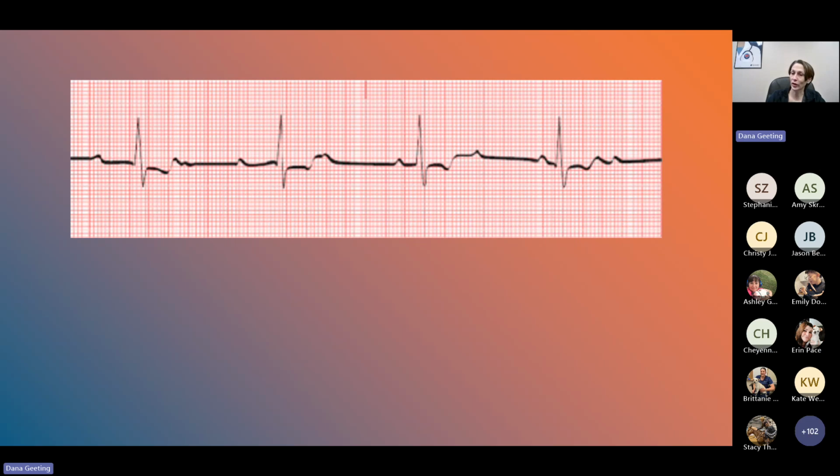First degree, again, very hard to tell. First degree are very hard to tell just looking at them on your heart monitors. A lot of times you would have to print out a monitor strip to properly assess, because in first degree AV block, your PR interval right here is going to be longer than 0.20. So longer than the 5 blocks.